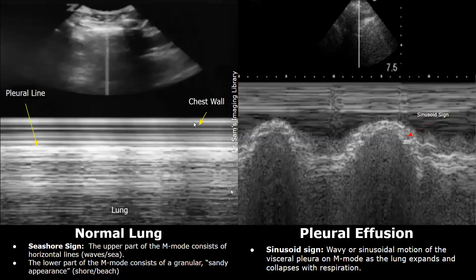This entire appearance on M-mode is called the seashore sign. In cases of pleural effusion on M-mode, we will see a sinusoid sign — a wavy or sinusoidal motion of the visceral pleura is seen as the lung expands and collapses with respiration. You will see this wave on the M-mode of a lung with pleural effusion. This sign is helpful in diagnosing pleural effusion on ultrasound.